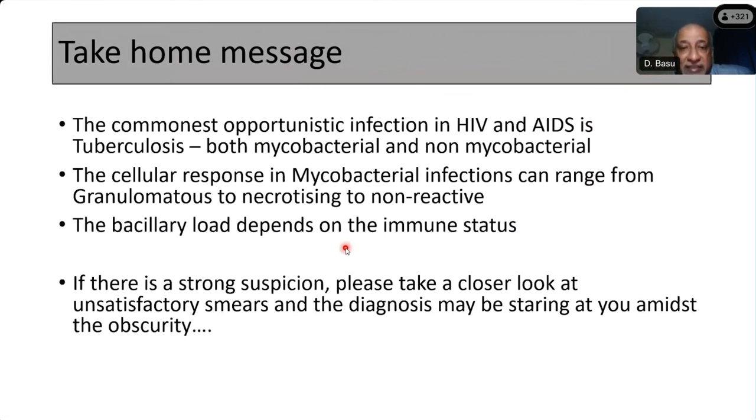Understood? Basically unstained bacilli. As you know, once you do the Ziehl-Neelsen stain, that is what makes it acid fast, the mycolic acid. So the routine Romanovsky stain cannot penetrate into the bacilli, so they look like a negative image.